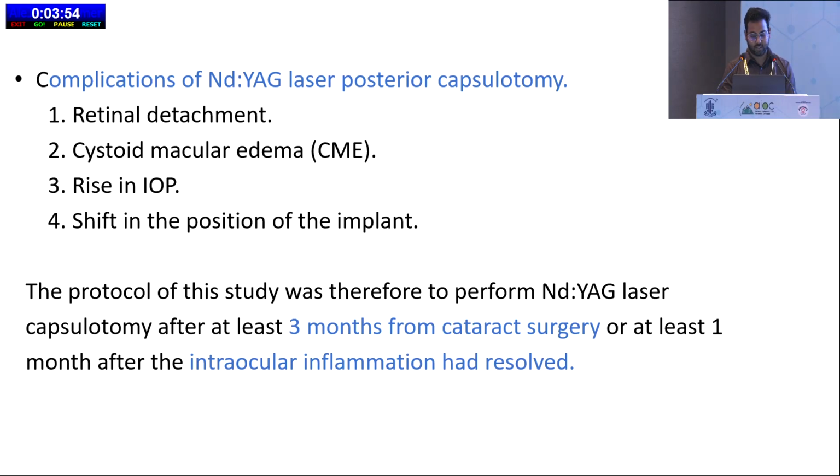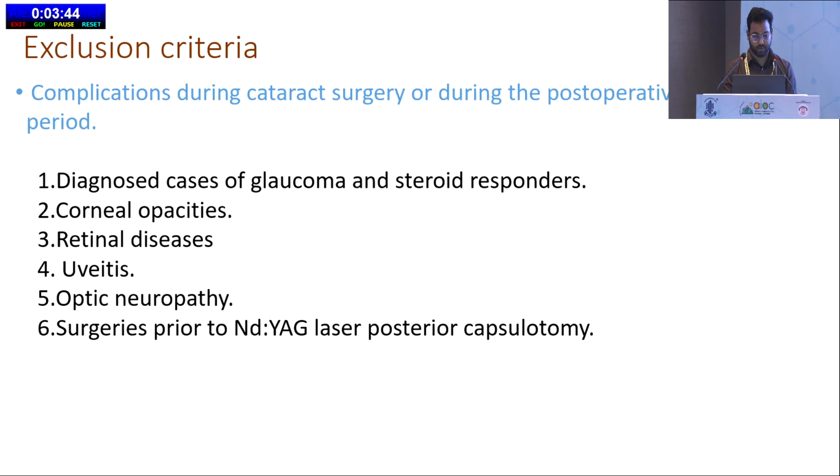The protocol of this study was therefore to perform the Nd:YAG laser capsulotomy at least 3 months after the cataract surgery, or at least 1 month after the intraocular inflammation had resolved. The exclusion criteria are diagnosed glaucoma and steroid responder, corneal opacity, retinal diseases, uveitis, optic neuropathy, and surgery prior to Nd:YAG laser capsulotomy.